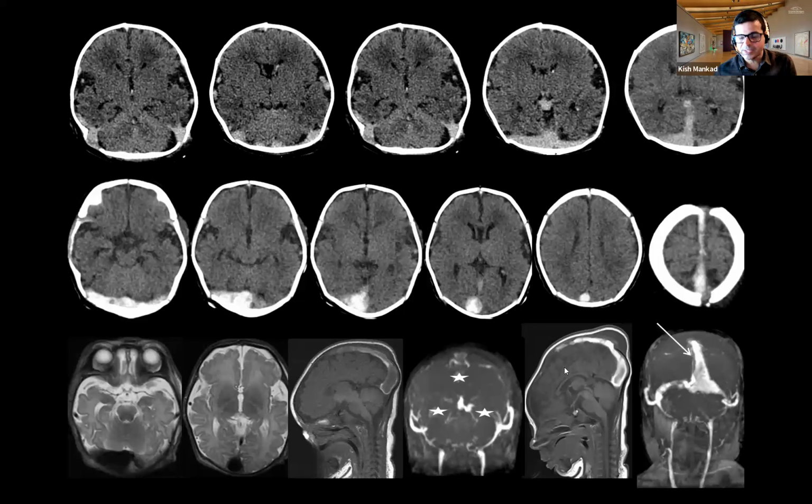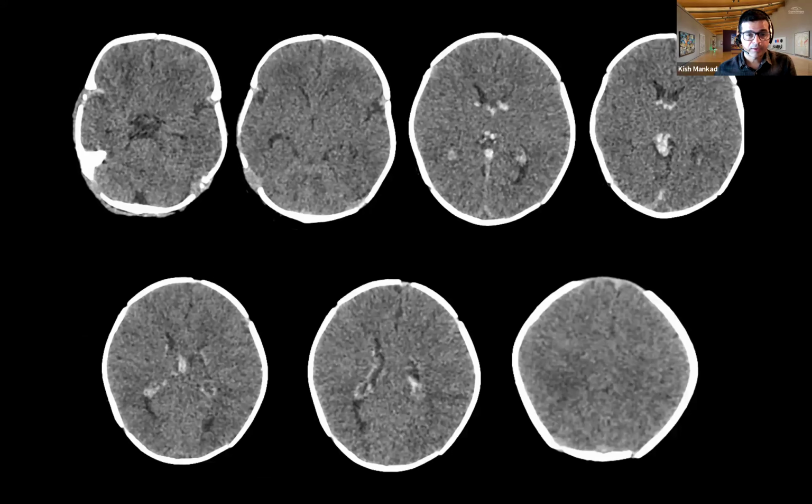And this was the day 15 repeat scan. And this time you can see that the clot is actually enhancing in there. At least most of it is enhancing. So it becomes even more difficult. Venous sinus thrombosis is hard and it's confusing and scary, frankly, to anybody. And till date, I do worry about the patients when I look at appearances like these.